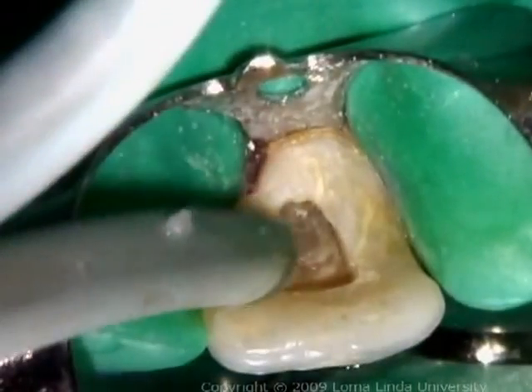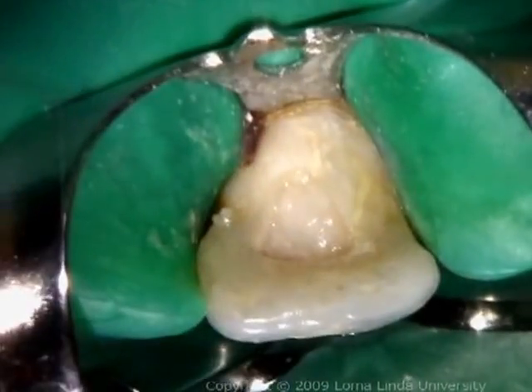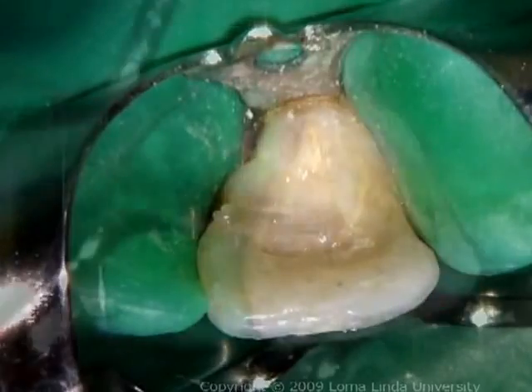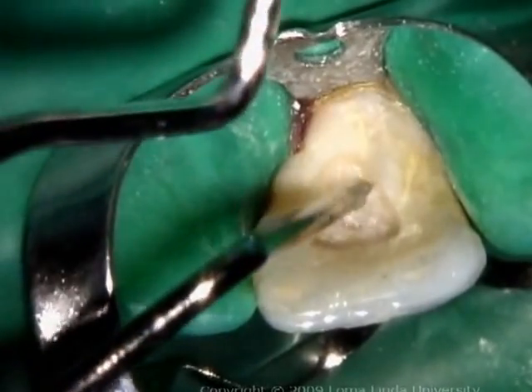The walking bleach paste is prepared by mixing sodium perborate and an inert liquid such as water, saline, or anesthetic solution to the consistency of wet sand. With a plastic instrument or an endodontic plugger, the pulp chamber is packed with the paste.